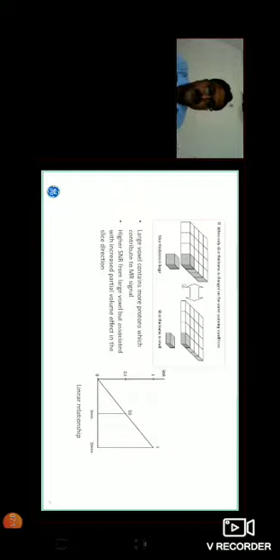I just reduce the slice thickness. You can say that just reduce the slice thickness into half. So the voxel volume is reduced, and the number of protons in each voxel is also reduced. That means signal is less, SNR is less. So you can see the linear relationship between the slice thickness and the SNR. So the 10 mm slice, the SNR is 1, and if I am reducing it to half, the SNR is also half.